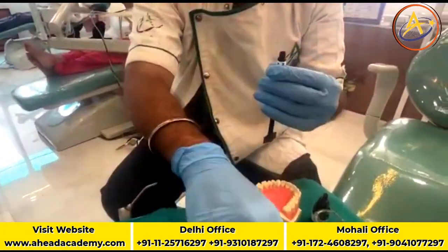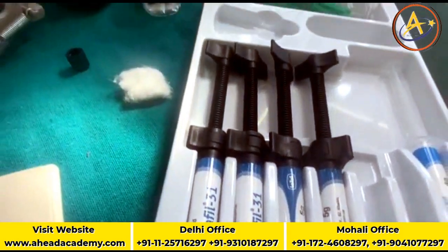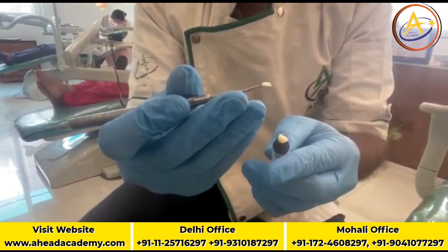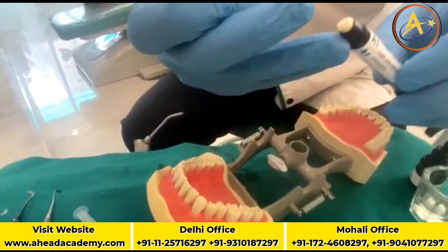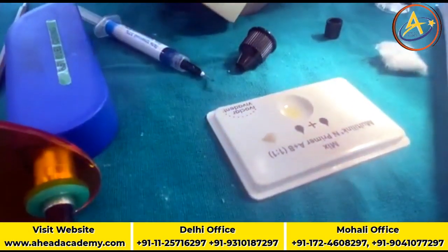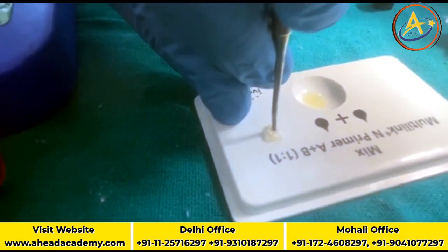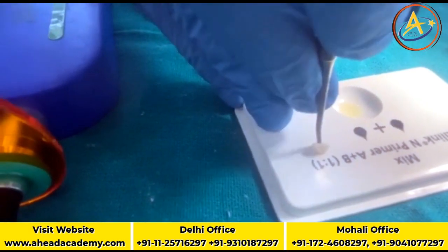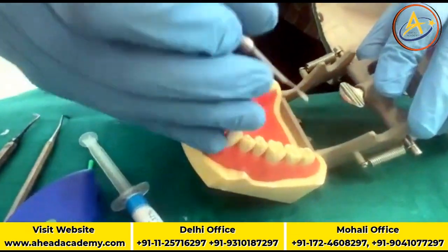Now, after curing of the bonding agent, now is the time to take the composite. Now, when you open it, I am taking out the composite. Just see, you have taken it, and straight away, some of the operators start applying it. Remember, this is wrong. When you take the composite, always take it on a clean surface. Then you have to knead your composite so that the resin comes onto the surface. Now you can see my composite is very, very shiny. Resin has come onto the surface. Now you can take the composite, apply it onto the cut surface and condense it.